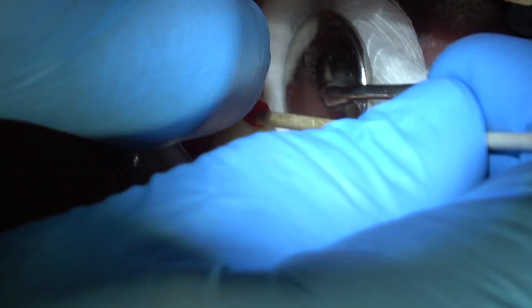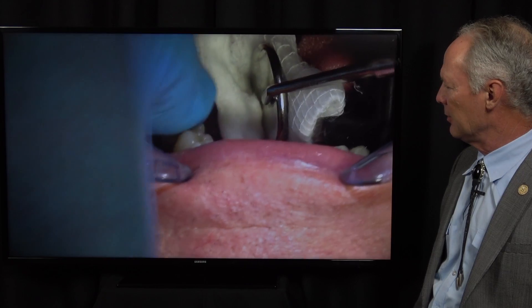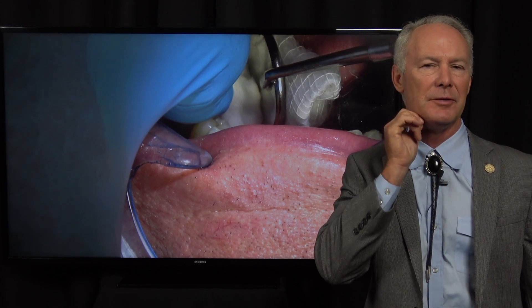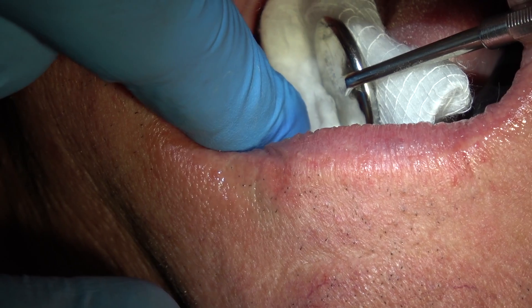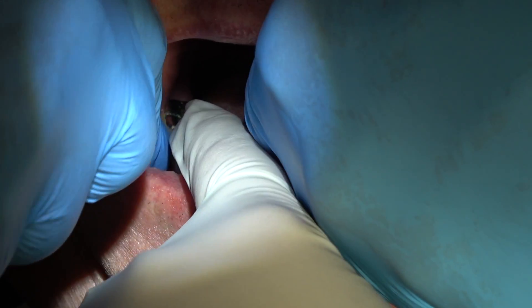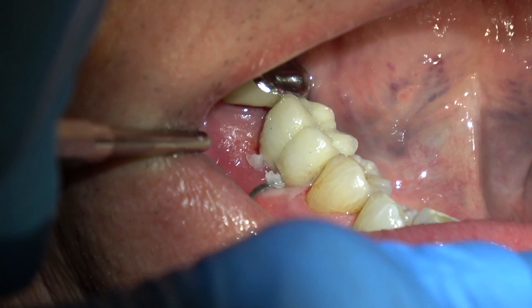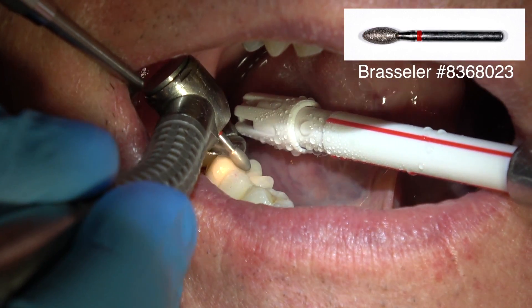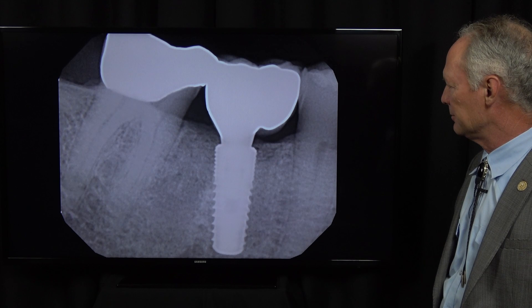I've got a cotton tip applicator with red rope wax on the tip as a carrier for the crown. All Vaseline'd up and I'm going to push firmly. I put my thumb on the crown and take a stack of two-by-twos, place those under the patient's mandible, and just squeeze slowly but firmly, holding it for 15 seconds. Then while it's setting, I'm going to floss mesial and distal of that crown — it should just pop right through. I let it set initially and remove the excess with floss with a knot in it, the back end of a scaler, and cotton balls held by cotton forceps. Then I'm going to check the occlusion and have the patient grind — I don't want any premature contacts on the implant and certainly no eccentric contacts on the crown. There's the final restoration.